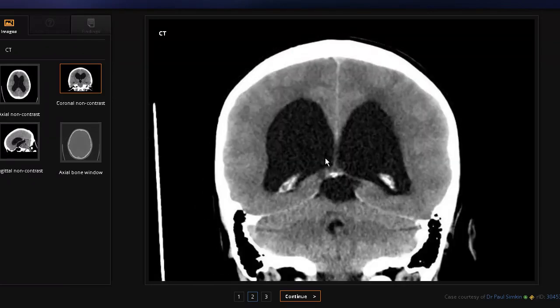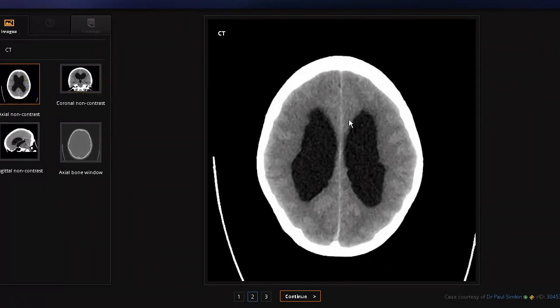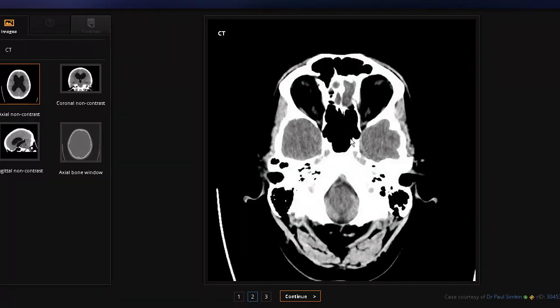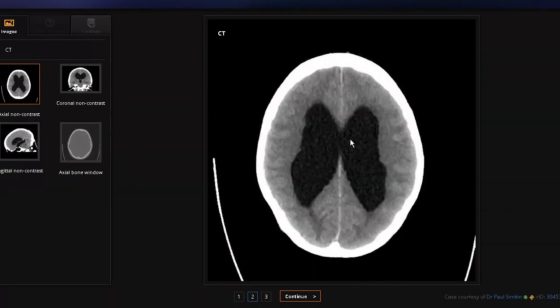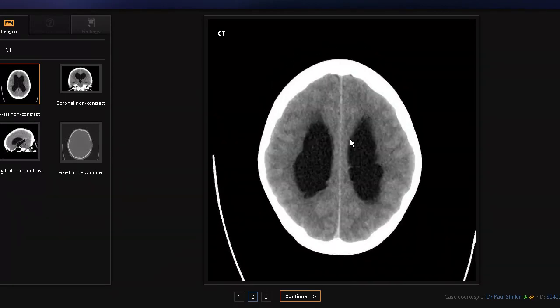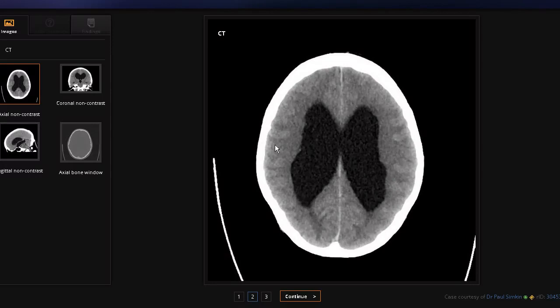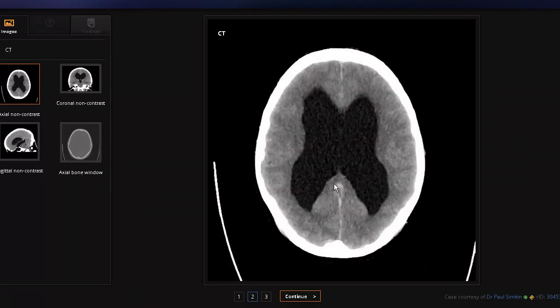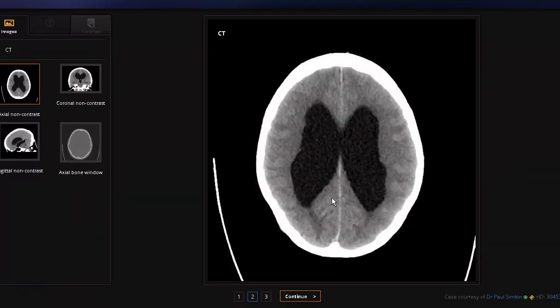Now looking at the lateral, third, and fourth once again — the axial section. This time we're looking at it from the bottom, with sections going from top to bottom. Here at the top, the lateral ventricles are dilated, C-shaped, with anterior, body, and posterior portions visible — the inferior is not visible here. You can see how they meet at the midline. The corpus callosum is on the roof on top, and on the back side is the formation of the cerebellum.